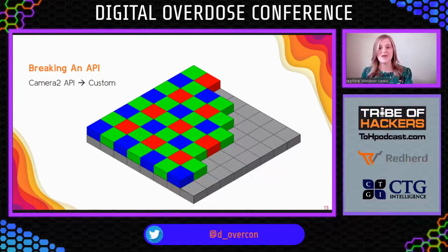It's got blank pixels and masked pixels, which are around the edge. They don't capture any light. They're just there to show the edge of the image, and it wouldn't be adjusted for anything like white balance. Unfortunately, we are trying to build a medical device, not a camera to display pretty images, so we need the actual raw image data. This is really difficult to get a hold of.